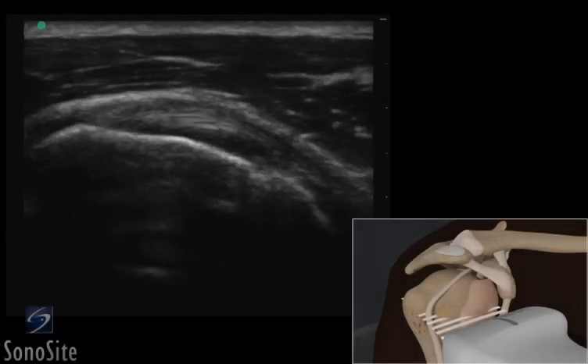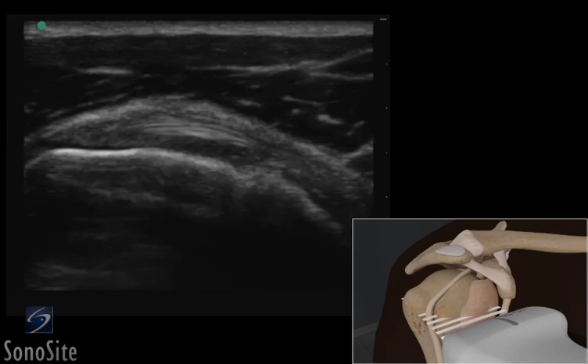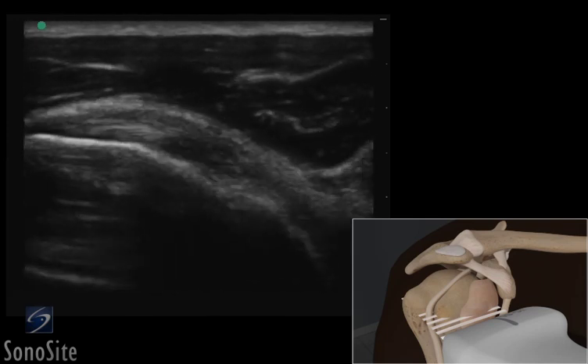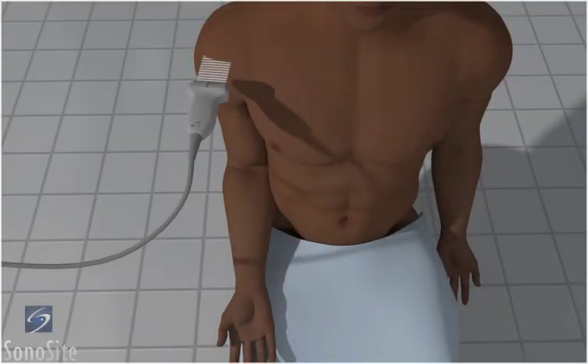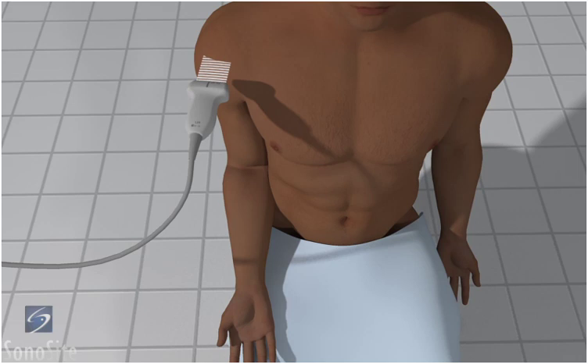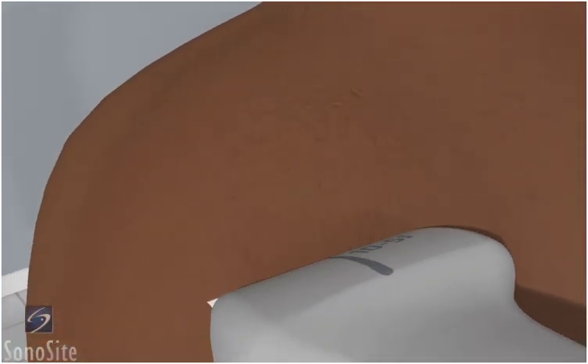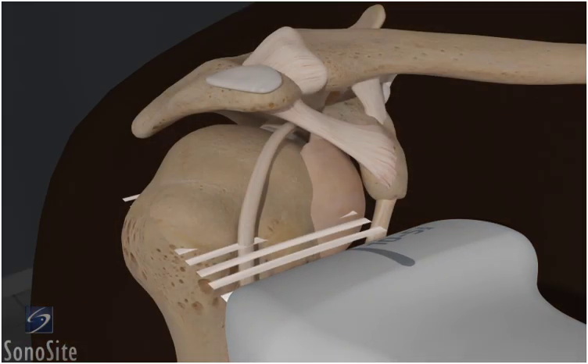A linear array transducer with a musculoskeletal exam type is used to perform an ultrasound examination of the subscapularis tendon. The patient is in a sitting position with the hand palm up and resting on the knee. The examiner is positioned in front of the patient and the transducer is placed transversely over the head of the humerus with the orientation marker directed to the patient's right.